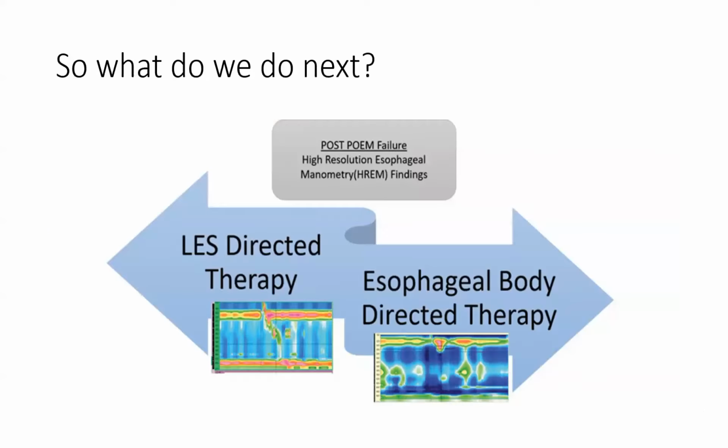Now, once we have defined that we are going to use manometry, having said that, I do not say that you use manometry in isolation. Obviously, in such redo cases, you want to have everything. You want to do a manometry, you want to do a timed barium, and you want to do an endoscopy. All of them come together if you really want to solve the problem of redo cases.